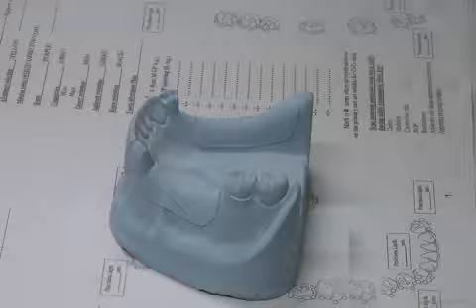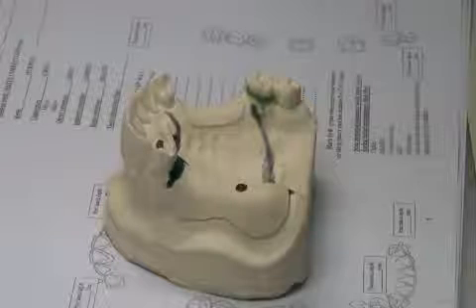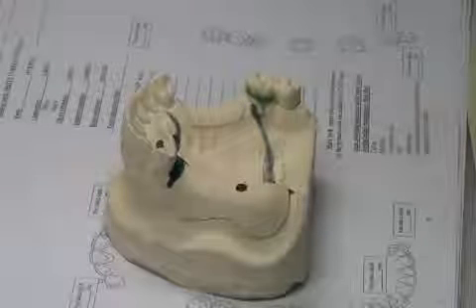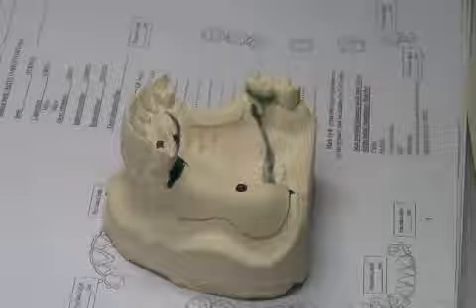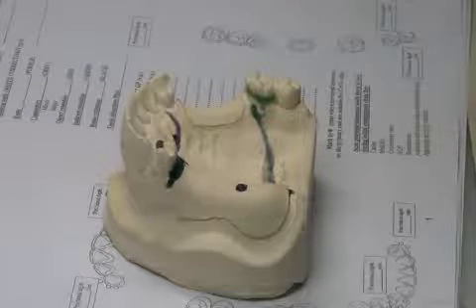The upper, what is the best major connector? The palatal strap. This is the best. Okay? We get the best support. It's the thinnest that we could produce. لأنه it's large, I could thin it, the metal is still strong, even if I make it thin. I could mimic the palate. I'm away from the gingival margins of teeth. So the best, let's say this is the very basic design.